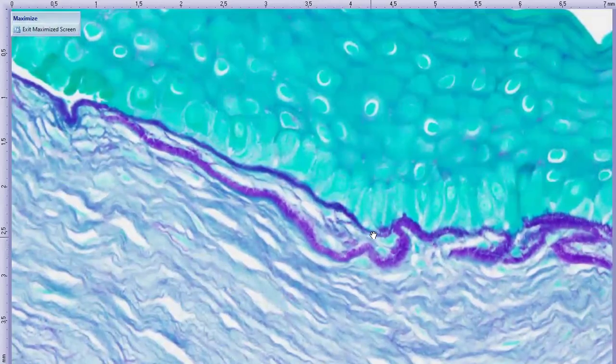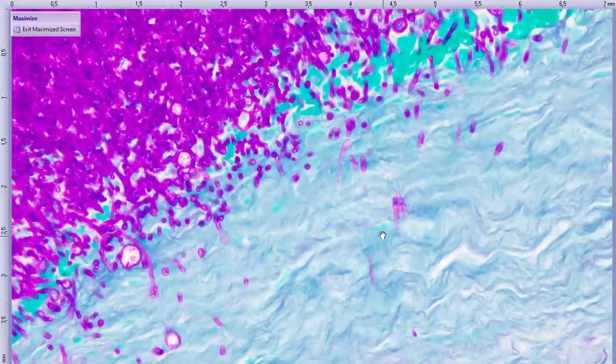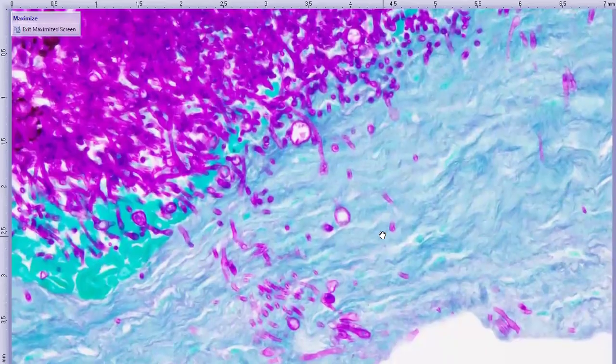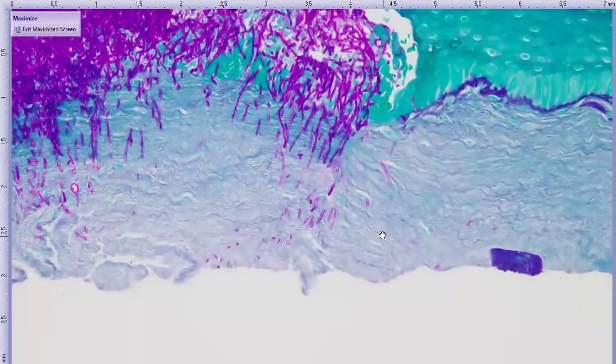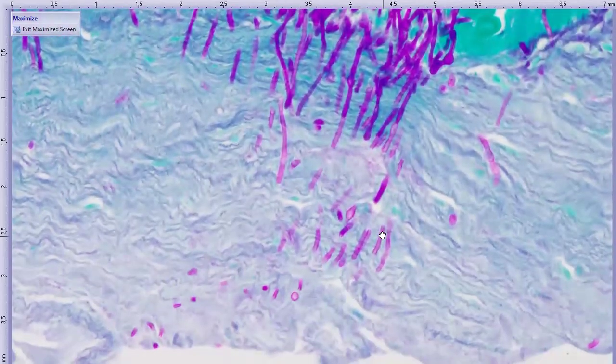Another interesting thing or debate that came after we saw this case was the fact that it was so localized, and when you see the histopath it's even more impressive, because you have these very localized regions. So we wonder about potentially a traumatic inoculation of those fungi. And it's interesting that you can see smaller lesions away from those big fungal plaques, where they're subepithelial. Very cool.